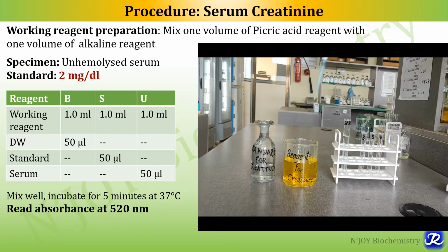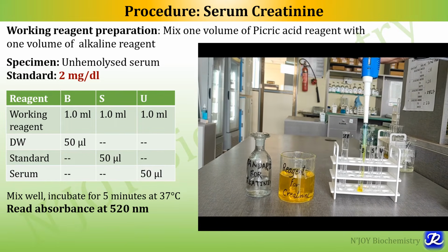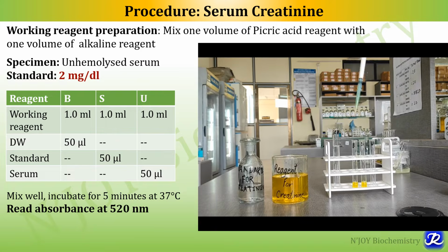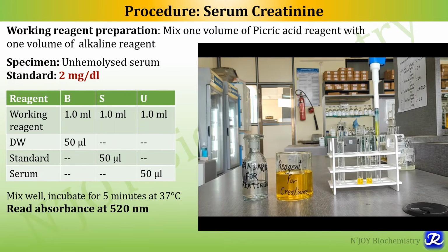This is the serum sample. So let's add 1 ml of working reagent in the blank, then in the standard test tube, and then in the unknown test tube.